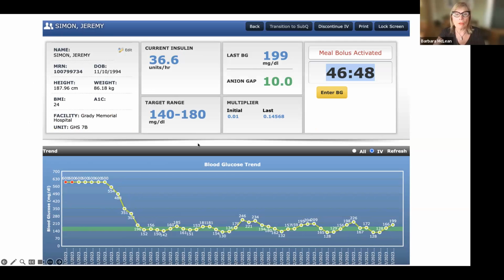Okay, so when I look at this patient, you can see when he first came in, he has these 2 red balls. That was called meter max. Meter max means anything above, at this time, anything above 600, the point of care meter cannot read. Okay, but all you ever enter into Glucommander, ever, is point of care. You never can put laboratory data in there, and I'm going to show you why, what actually happened to that patient that I mentioned earlier.